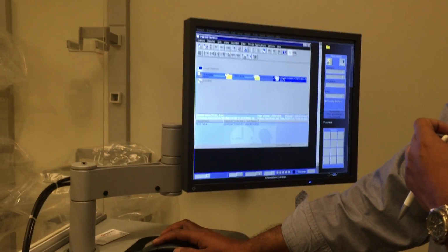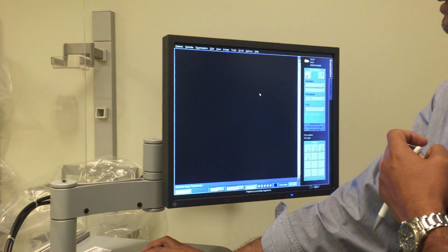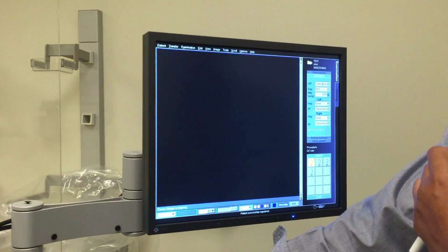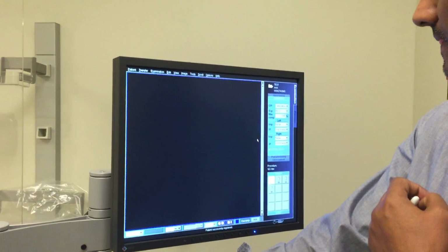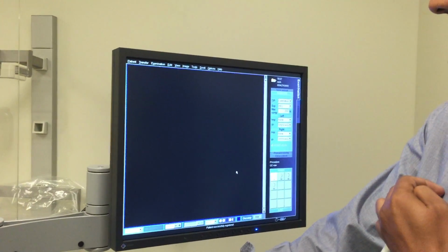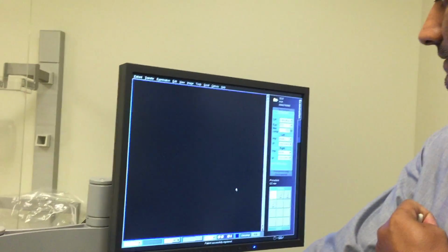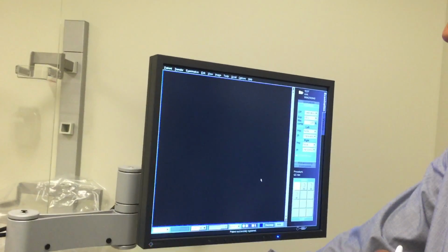So this one patient, probably it's a dummy patient, right? Just for testing. You see that procedure is already QC raw. Okay. For the calibration purposes. Okay. We have AEC 200 Newton. Oh, we can set up here, but it's in service mode. You said 78 Newton just now? That's all programmable. Yes, we do it at the service. Okay.